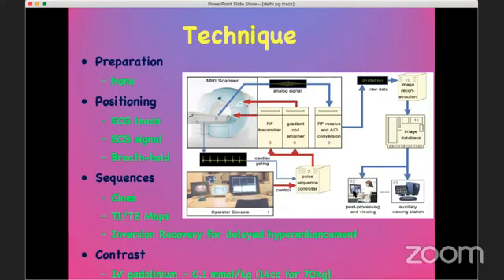So it's very important here that you have a good tech. You've got to train your tech. And many times, even today, I sit with my tech, especially when we're looking at difficult patients. Difficult patients means not the run-of-the-mill viability patients, but patients with congenital heart disease, patients with amyloidosis, for example, and I will tell you some of those challenges as we go along.